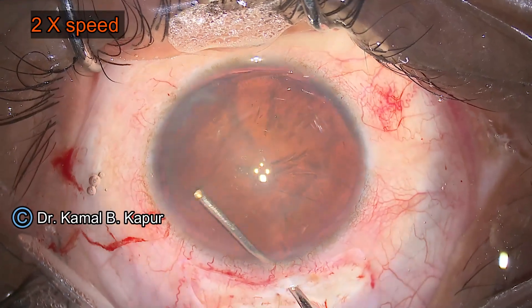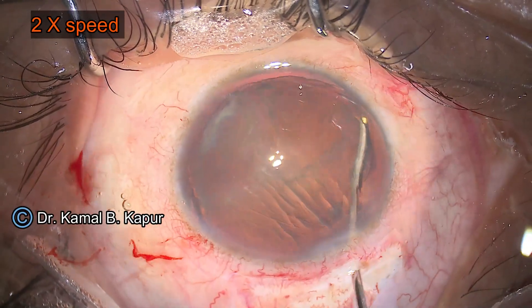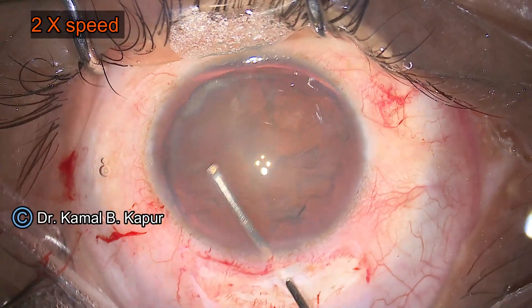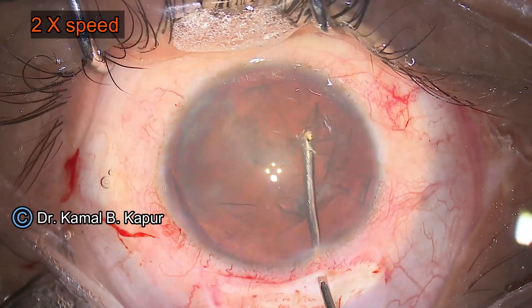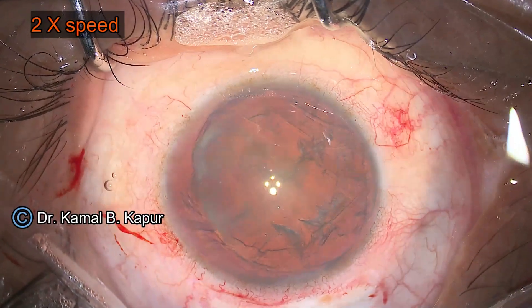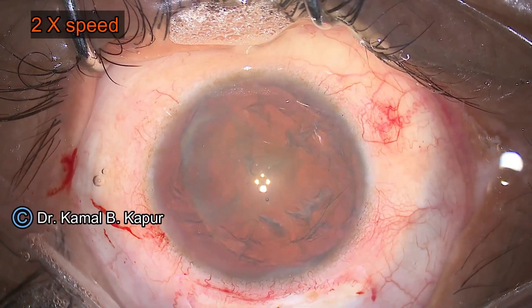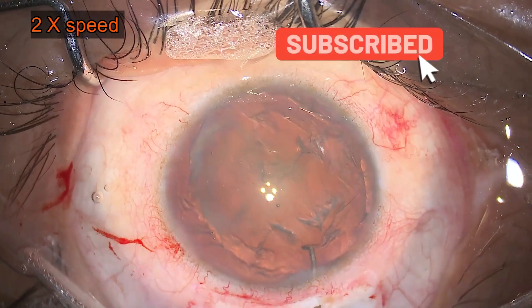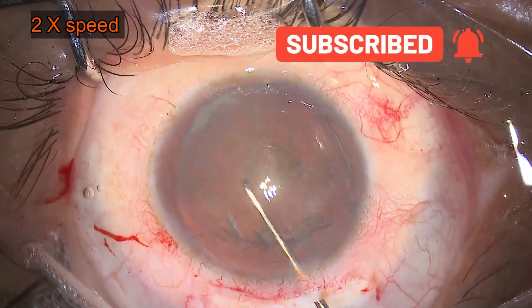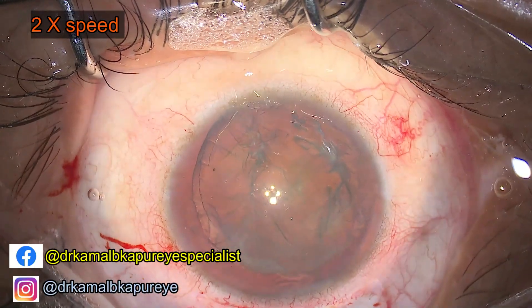As a normal surgeon may be accustomed to, we make a slightly larger capsulorrhexis — 7.5 millimeters in this case. If the capsulorrhexis is too small, the haptics will have trouble bending to go inside the capsular bag. And if you make it too large, the dialing of the leading haptic will cause prolapse or extrusion of the opposite haptic. So it's a good idea to keep the capsulorrhexis between seven and less than eight millimeters.